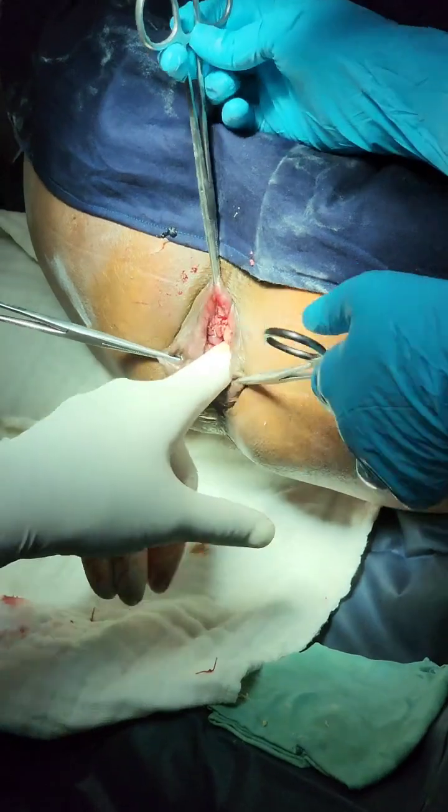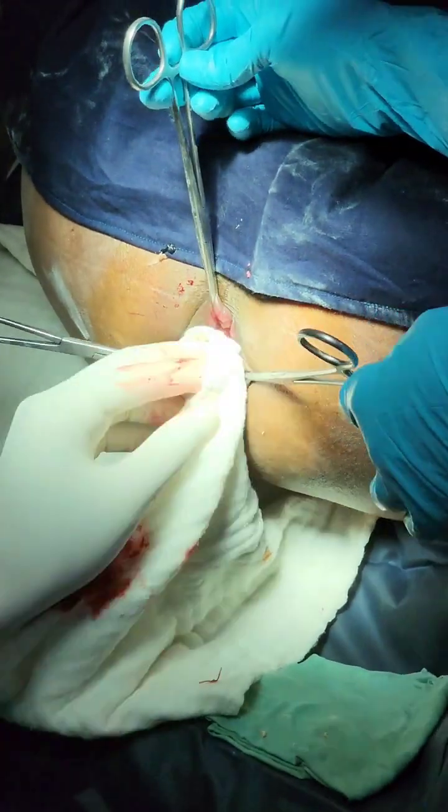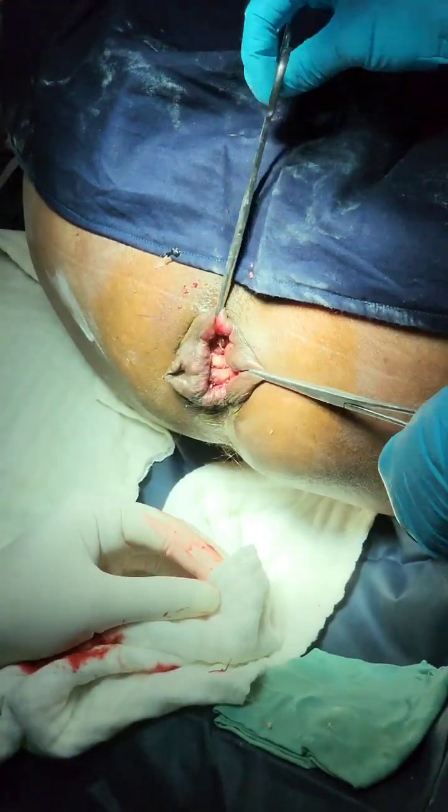We found this procedure to be quicker, convenient, less painful and an equally effective procedure for patients with advanced hemorrhoids. The procedure is completed by inserting and addressing the mucosal prolapse.